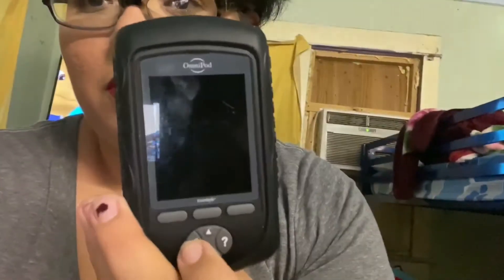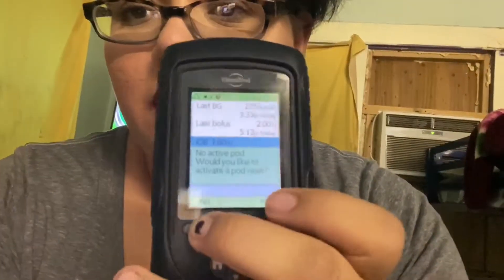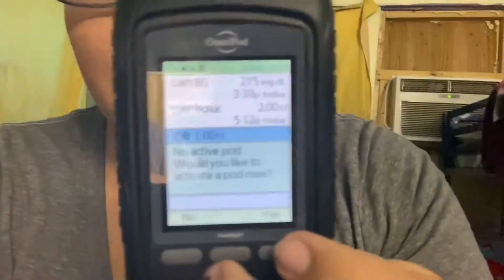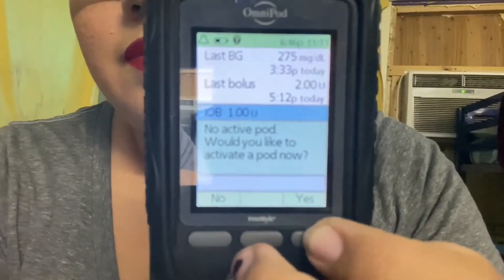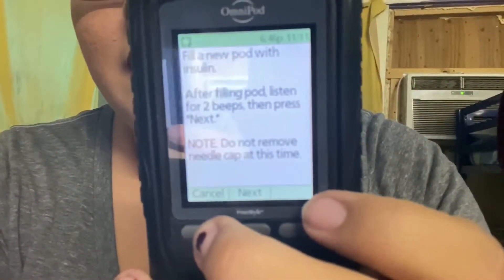We are going to confirm and then put yes — we want to activate a new pod. I think I can read this okay, so we need to fill up with insulin.